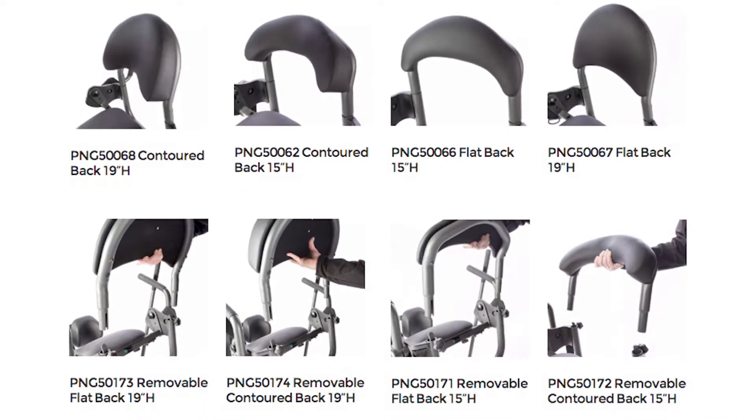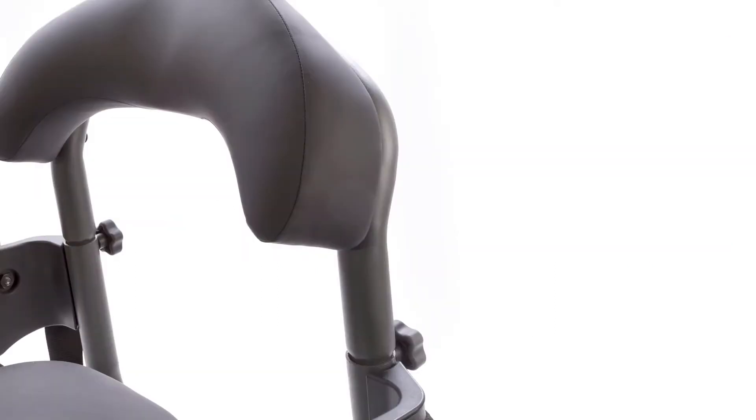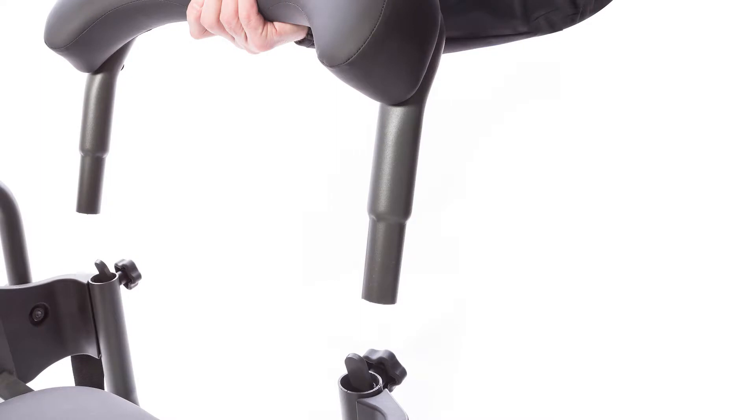Also available in either size or profile are removable backs. Two knobs easily release the back and provide rear access for patient lift transfers.